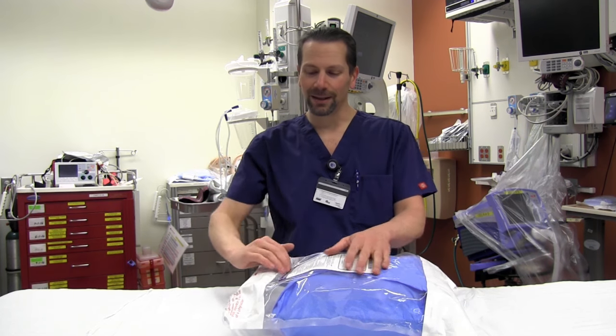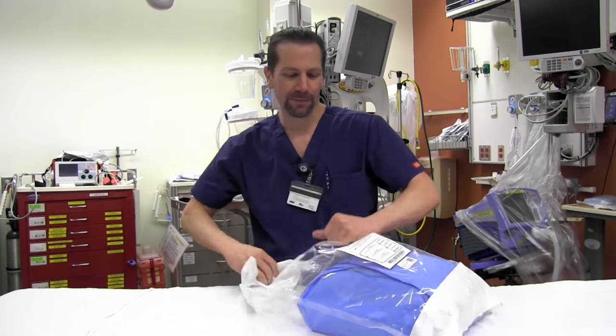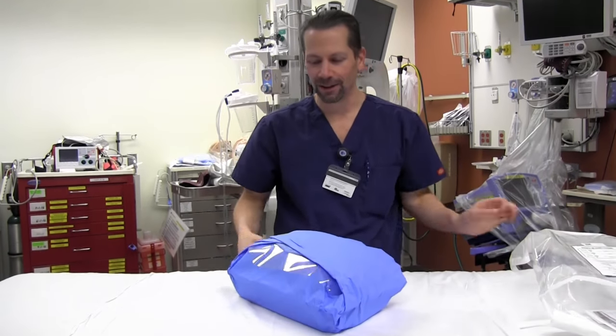So we did an extensive video on placing these long midlines. We're going to do a super quick attention deficit disorder version for people that just will not watch a half-hour video — I don't blame you.